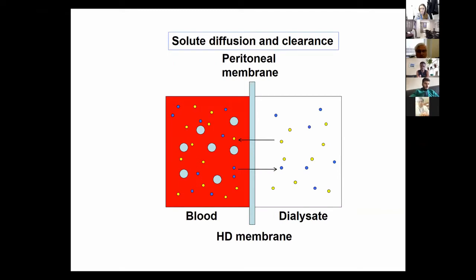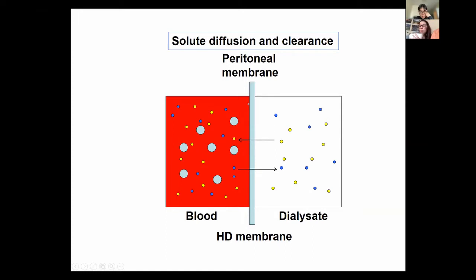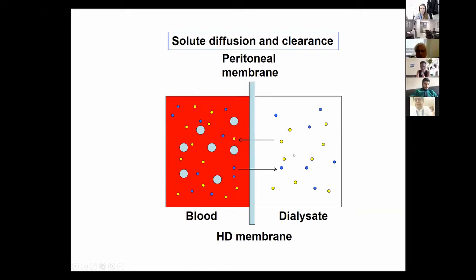And just as a reminder, in hemodialysis, can you guys see when I point there? All right, so in hemodialysis, remember there's the dialyzer that is a bunch of semi-permeable membranes, and we have diffusive processes that occur across the dialyzer. In peritoneal dialysis, we use the peritoneal membrane as our dialyzer, and the diffusion occurs across that peritoneal membrane between the peritoneal capillaries and the fluid that's sitting in the space, in this case a dialysate, and things go in both directions, both in hemo and in PD. So we're using the peritoneal membrane as our dialyzer.